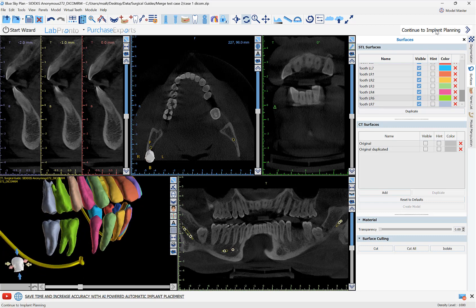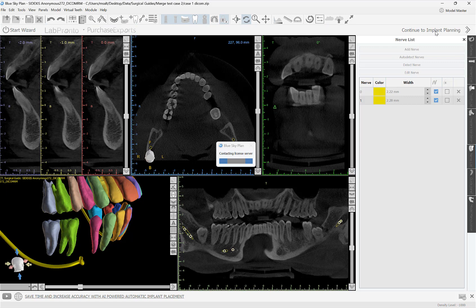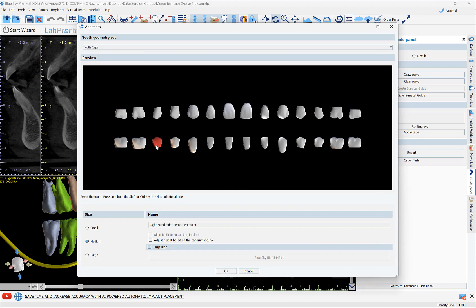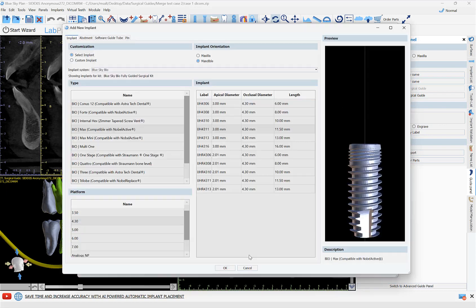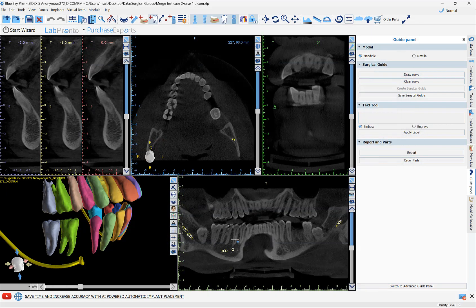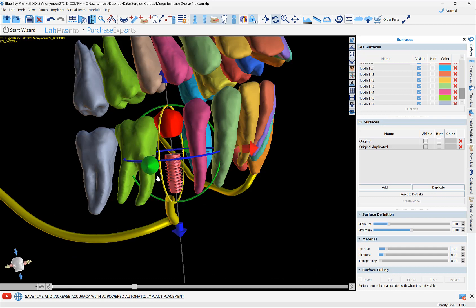If we want to proceed to treatment planning the implant, we can click 'Continue to Implant Planning,' add a crown together along with an implant. We click here to select the relevant implant and then click OK.